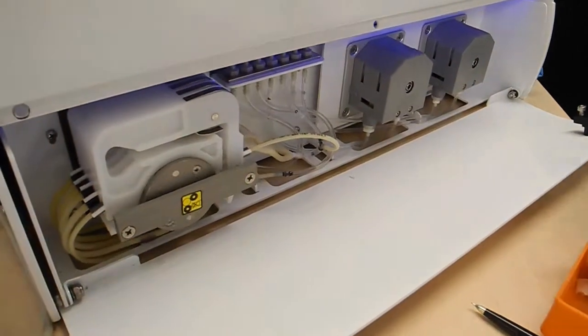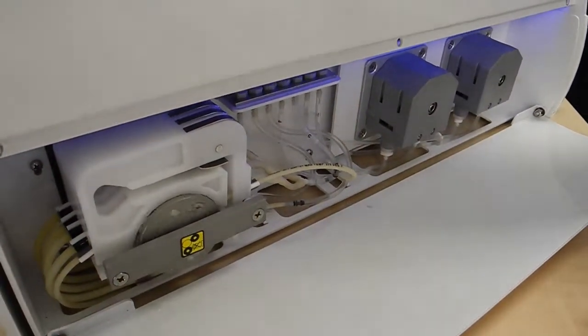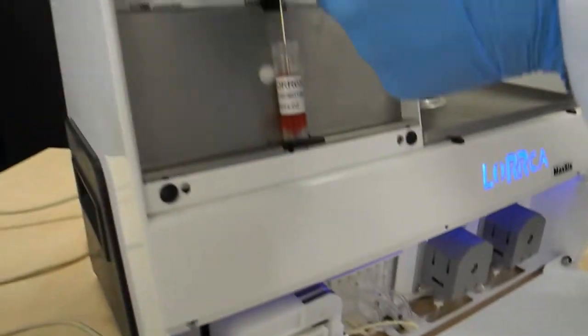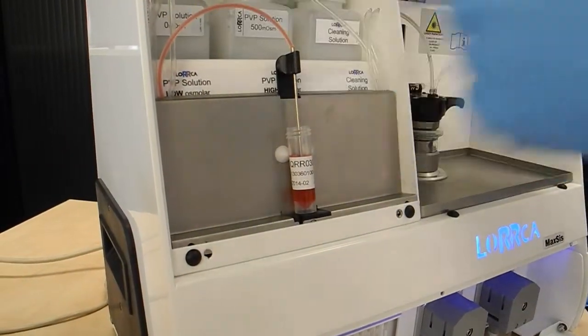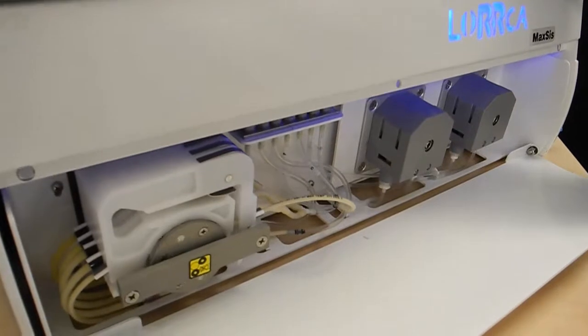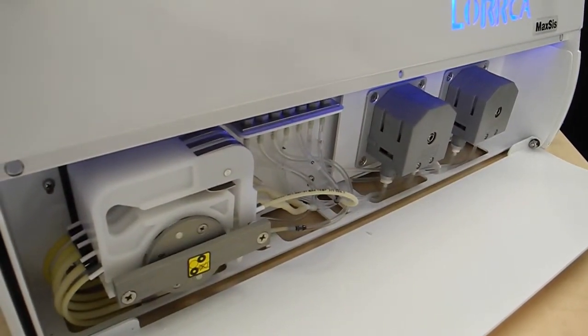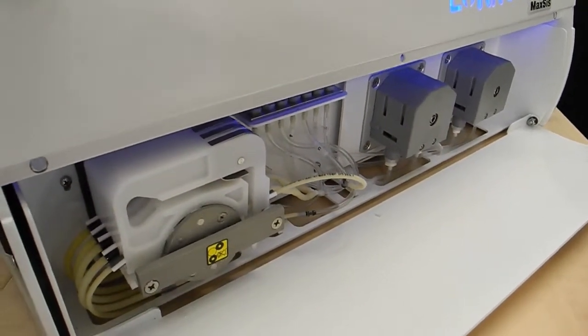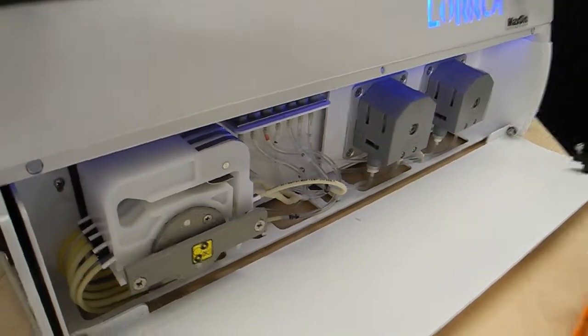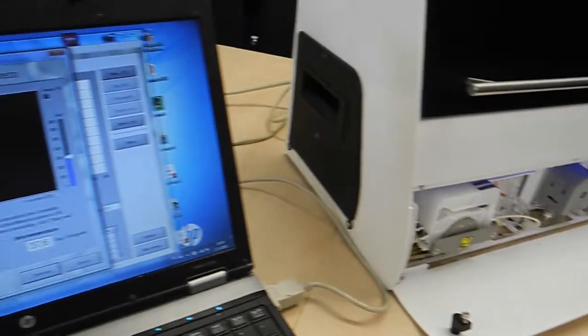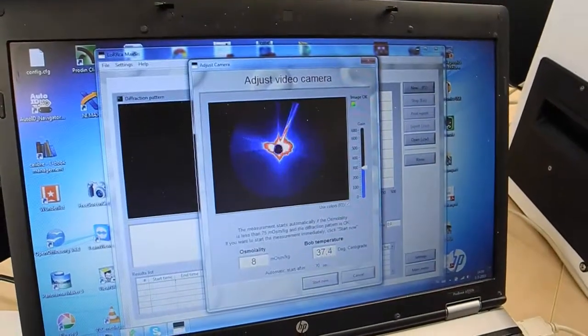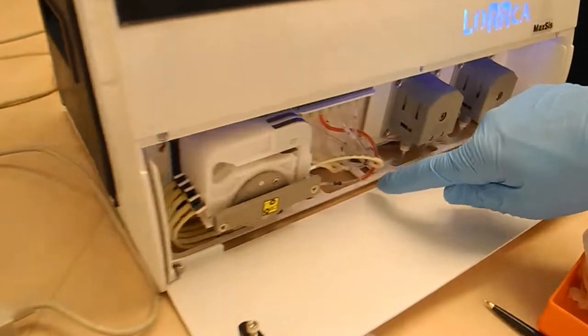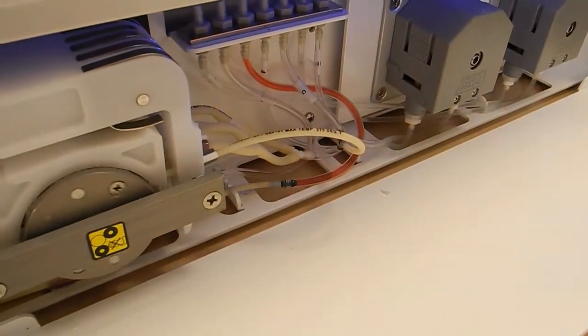Here you see the sample moving. Take a look at the screen where there's no good image yet, and there you see the sample approaching.